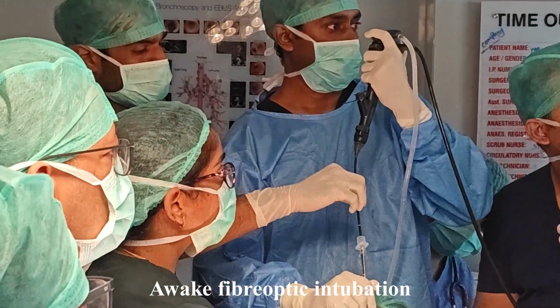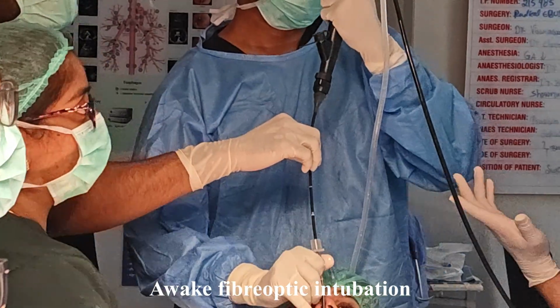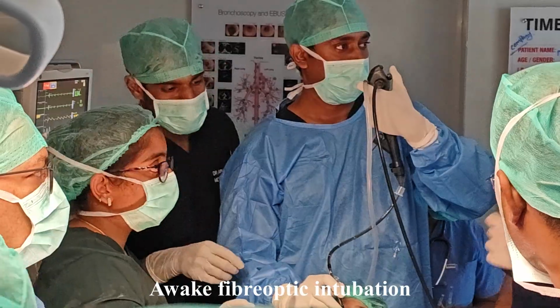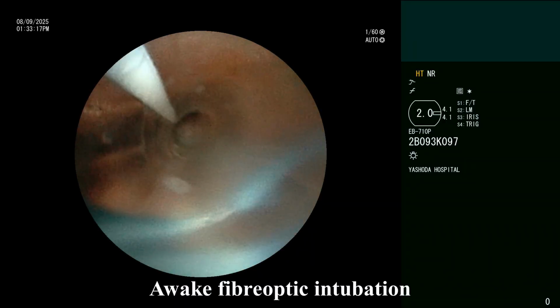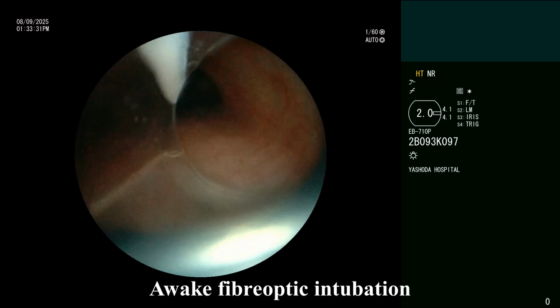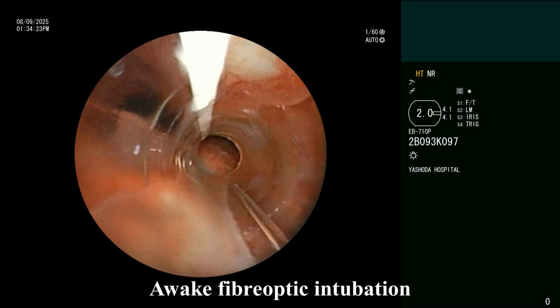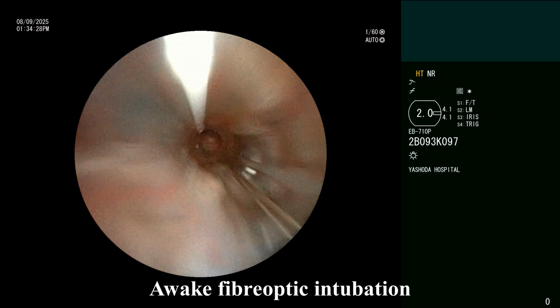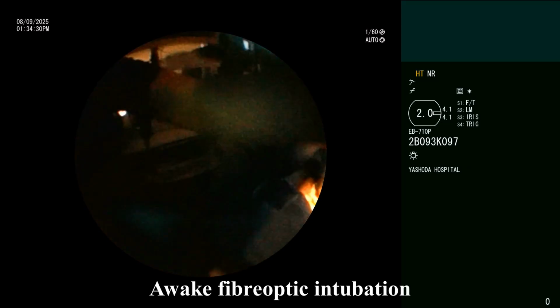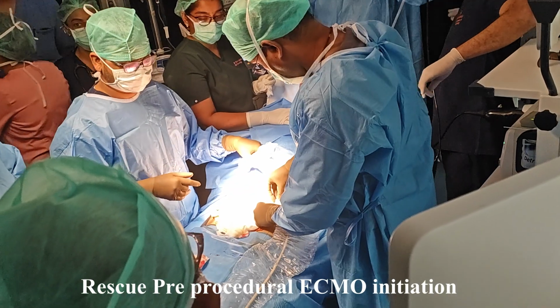So a decision for an awake fiber optic bronchoscope is made without the need for any sedation. The bronchoscope is passed preloaded with a microlaryngeal tube, and the scope is negotiated through the site of the airway obstruction, and the tube is passed beyond the site of the airway obstruction, and the airway is then secured. Once the position of the tube is confirmed beyond the site of the obstruction, sedation and paralysis are given and the patient is put on mechanical ventilation.